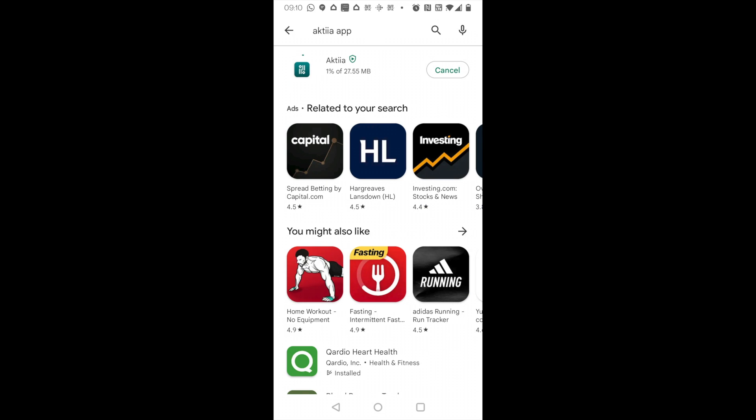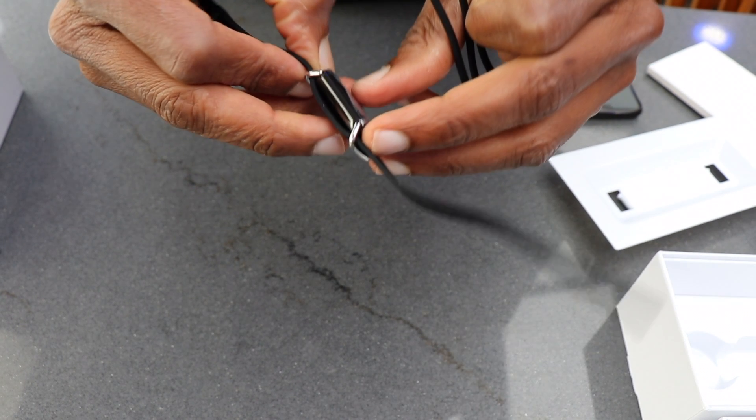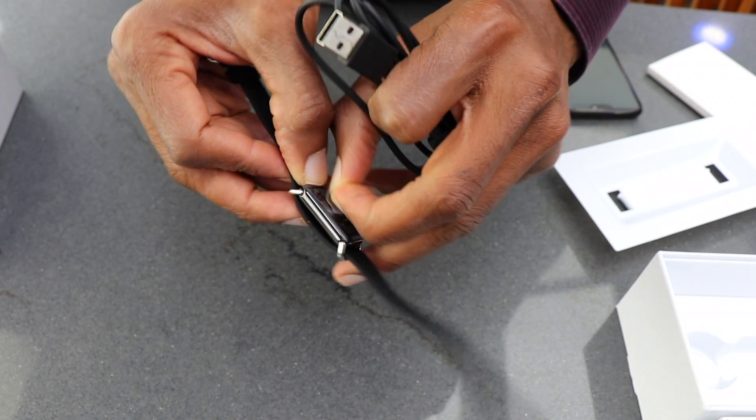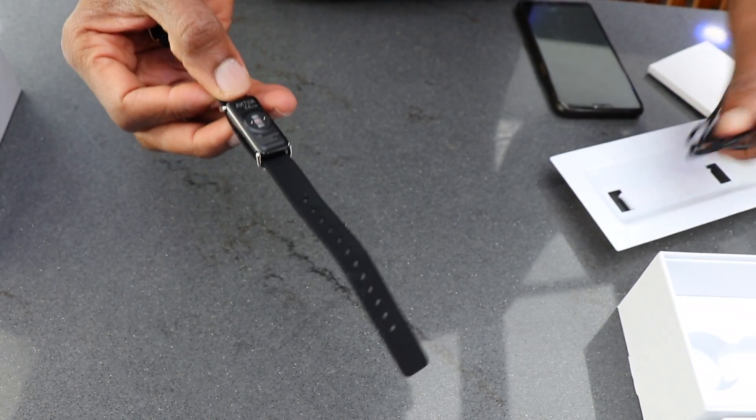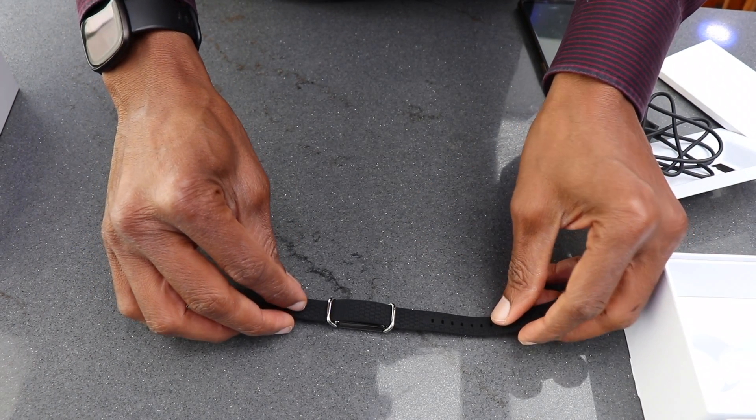Once you've downloaded it, then install. This is the screen you would see once the download is successful. Remove the film from the sensor at the back and get ready to pair the wristband with your app.